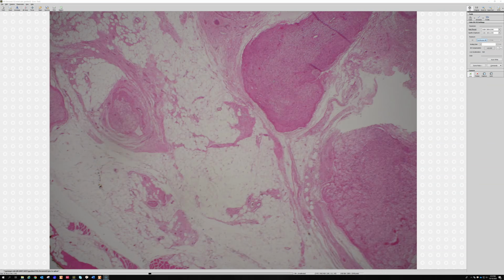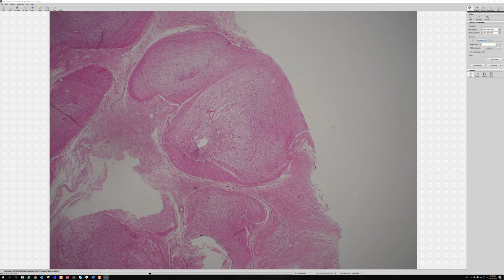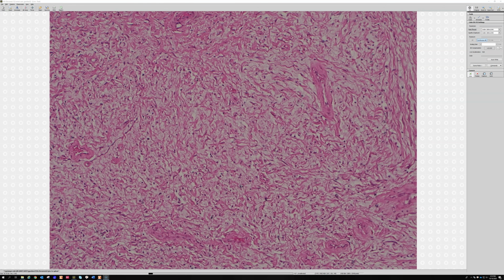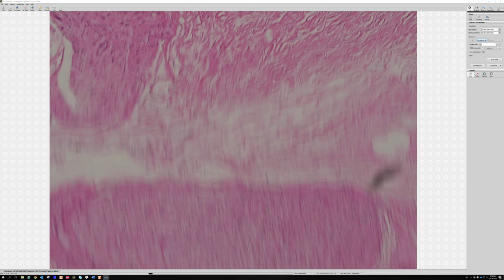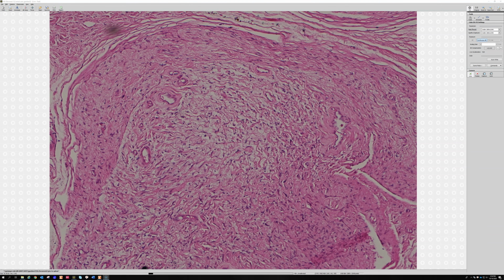In the middle, we're down near the fat and near the muscle, so in the deep subcutis. And when you go closer to one of these individual nodules, you'll see oftentimes in these big, deep plexiform neurofibromas the shredded carrot pattern. I feel like in cutaneous little nodular neurofibromas in the skin, you don't often see this very well. But the big plexiform ones, you see these little thin wisps of collagen, a little bit of loose myxoidy background, and then small bland Schwann cells scattered in there, and fibroblasts and perineurial cells all mixed together.